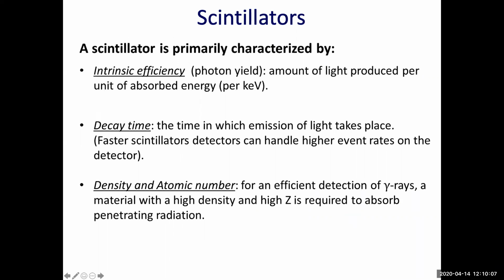A scintillator is primarily characterized by intrinsic efficiency, decay time, and density and atomic number. Intrinsic efficiency, or photon yield, is the amount of light produced per unit of absorbed energy. How many light photons will you produce per keV of incident radiation? This is the intrinsic efficiency.